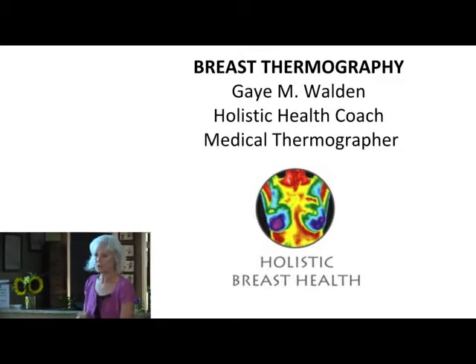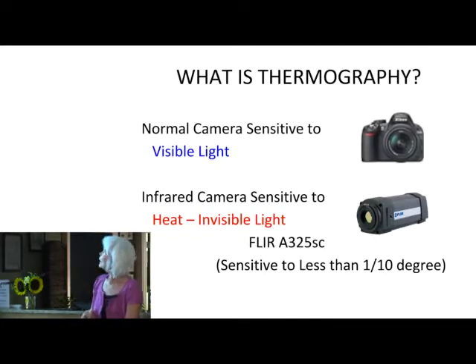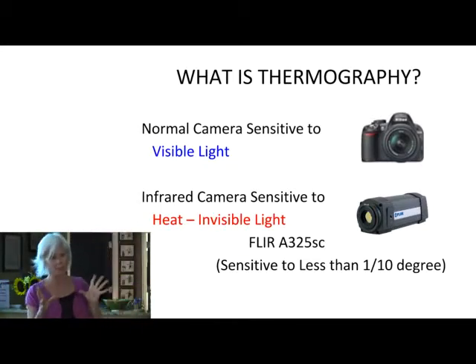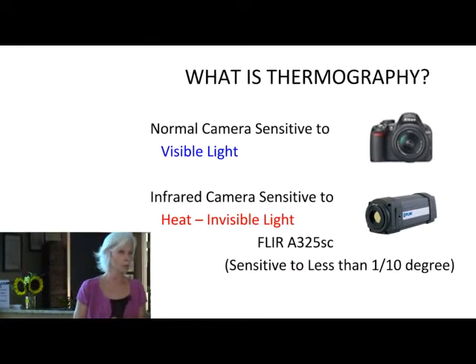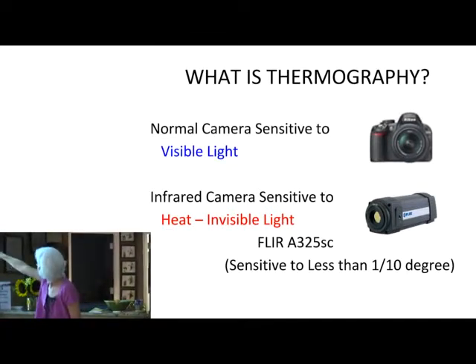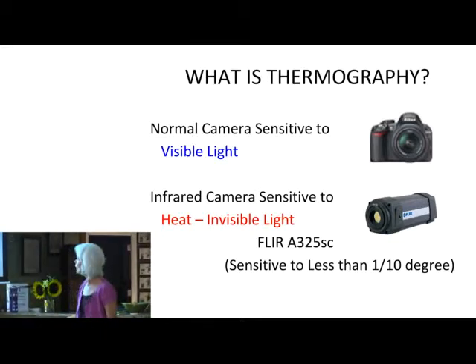Effie, let's do the next slide here. Now, thermography uses a very sophisticated infrared camera. All you need to do thermography is a camera, a thermographer, someone who takes the images like a photographer, and an interpreter or evaluator. That person is the most important person because that person interprets and evaluates the images. So this is my camera here, the little thing here, the FLIR. A normal camera is sensitive to visible light, and of course infrared is measuring heat.